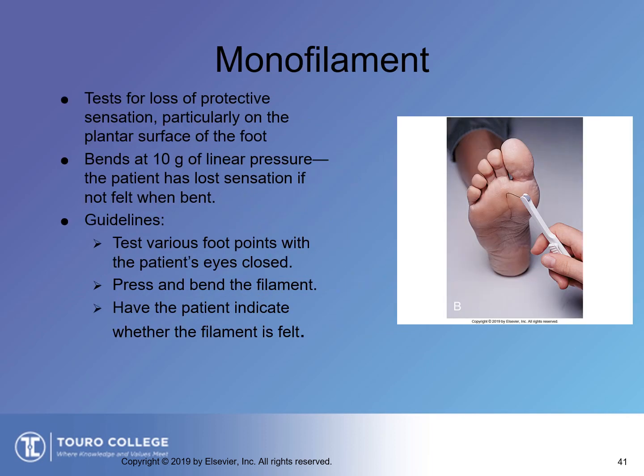Monofilament, you use this in your diabetic patients, and this is a test for a loss of protective sensation, particularly on the foot. It's kind of like a stick that has a plastic monofilament attached to it.